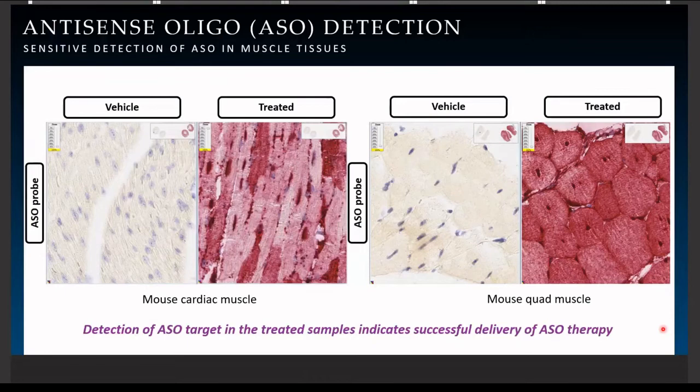So overall, the RNAscope technology, which includes all these three assays, has been applied quite widely in recent years in preclinical models, but with very strong clinical applications to understand the efficacy, biodistribution, and the safety of these therapies, which is extremely important going forward before translating into actual clinical treatment.